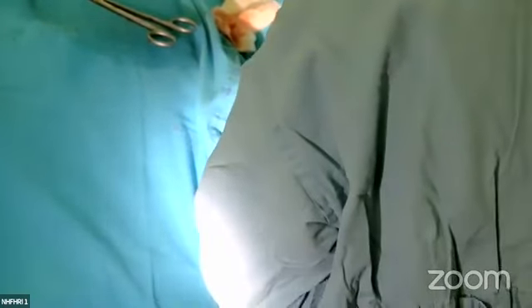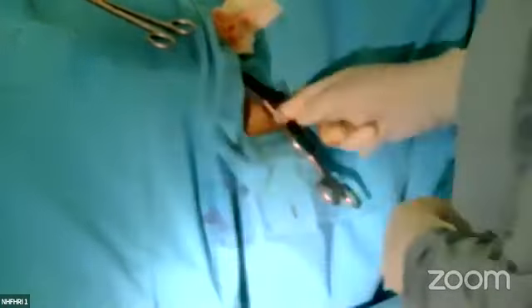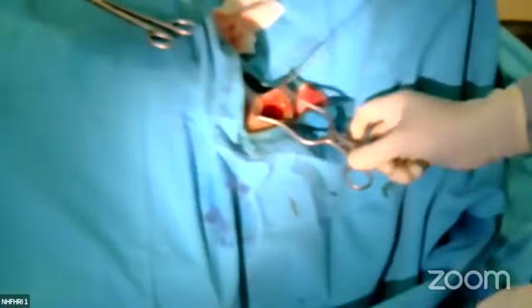Then making the pocket deep to the deep fascia over the pectoral muscle. Sometimes an intermuscular pocket may be necessary in very thin and small kids. So this is the pocket I am making. Around 2 finger accommodation is sufficient. This is the pocket.